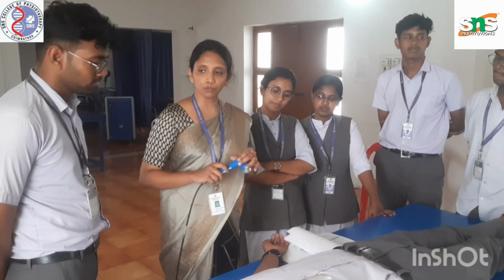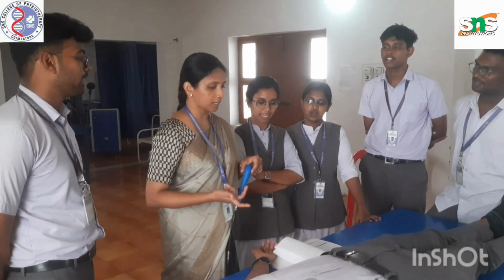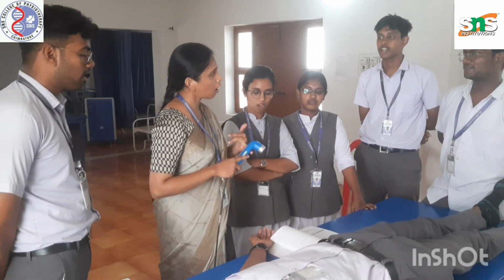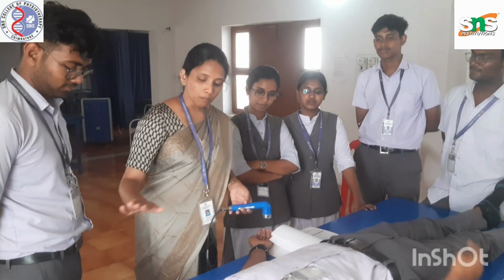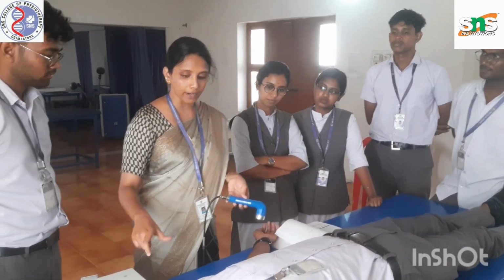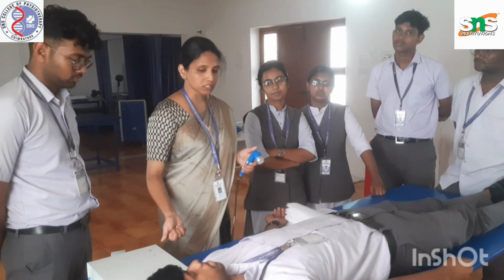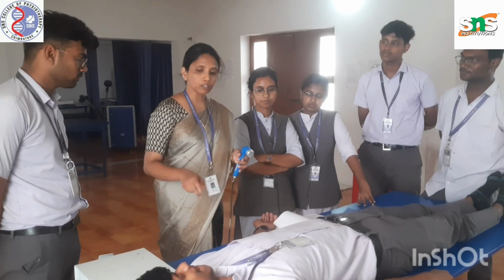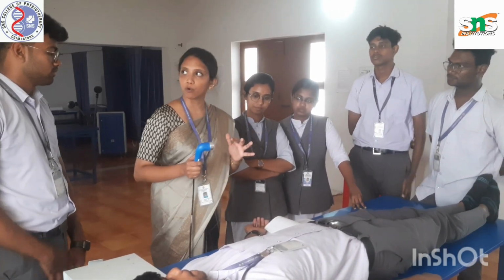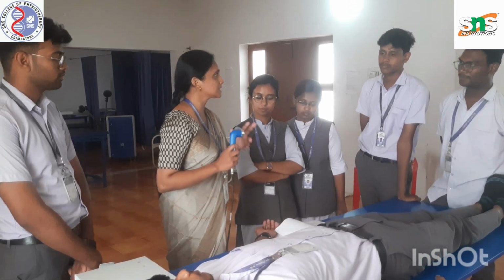In pulsed mode, what is the mark-space ratio? Off and on time. Mark for on, space for off time. The ultrasound apparatus itself will turn the ultrasound beam output on and off when you set the ratio. So when you set a 1:1 ratio, 1 millisecond will be the ultrasound output, and the other 1 millisecond will be the output off time, that is the cut-off time.